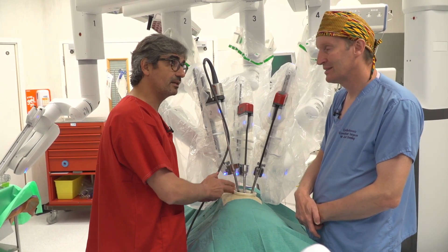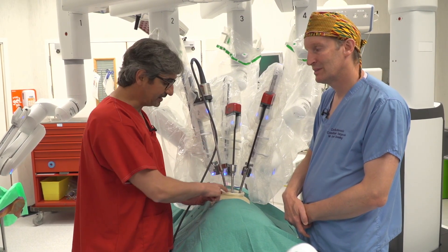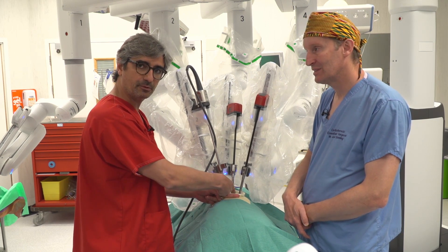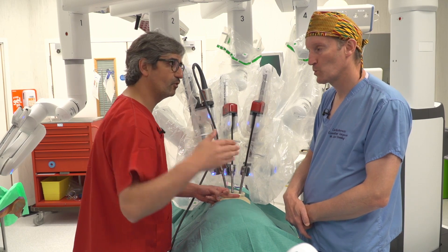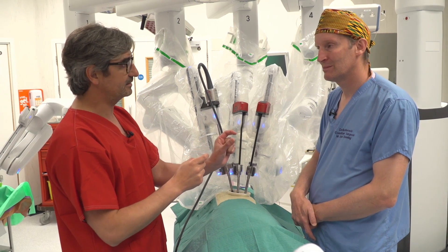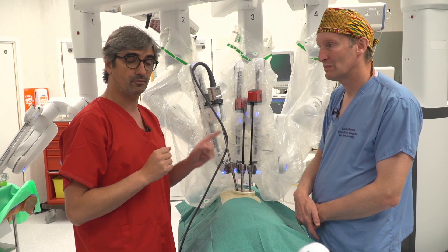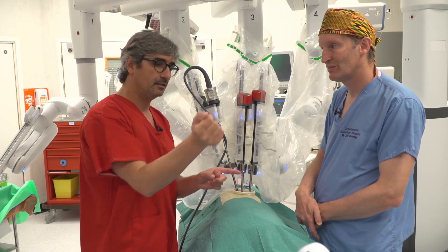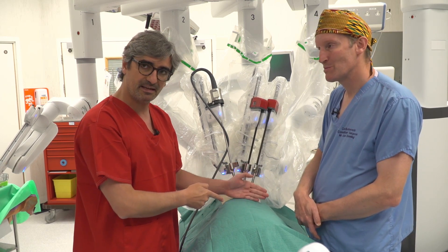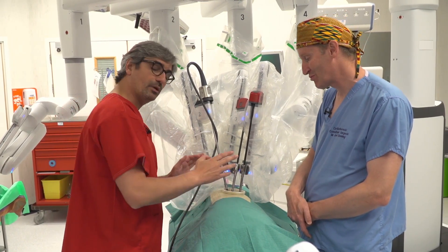For pure RATS, the incision cannot be at the same place as uniportal VATS. We normally place uniportal VATS at the fifth intercostal space, but for pure uniportal RATS the incision should be lower — normally at the seventh intercostal space. Why? Because if you put the incision at the fifth intercostal space for a right upper lobe, when you go to place the robotic staplers you don't have enough angulation to reach the vein or the artery in front of you. You need minimum length to allow the robotic stapler to go in and rotate with freedom. Placing at the seventh intercostal space, you don't have problems reaching the apex because the robot is designed for this purpose.